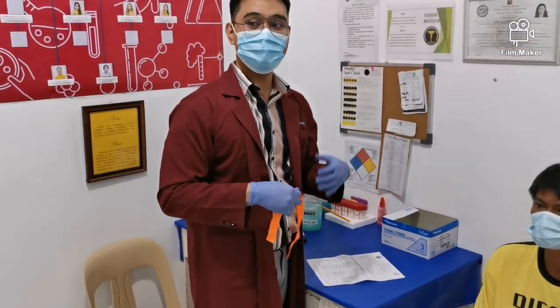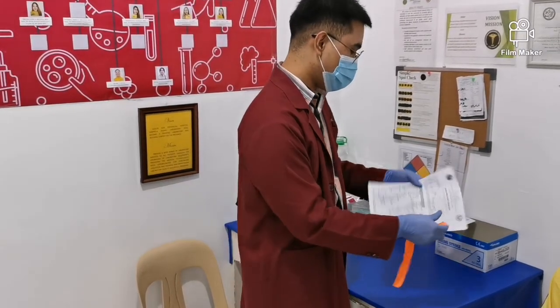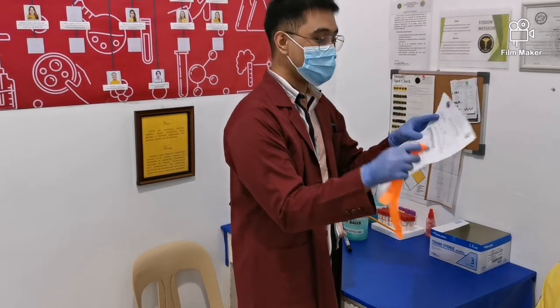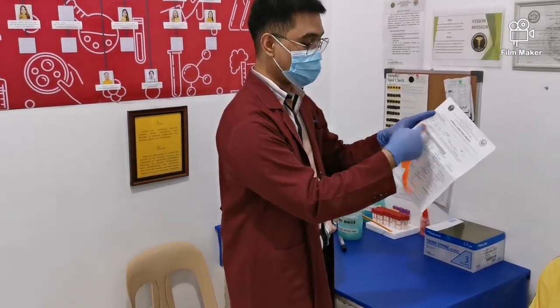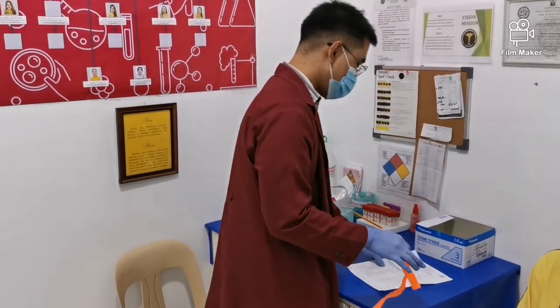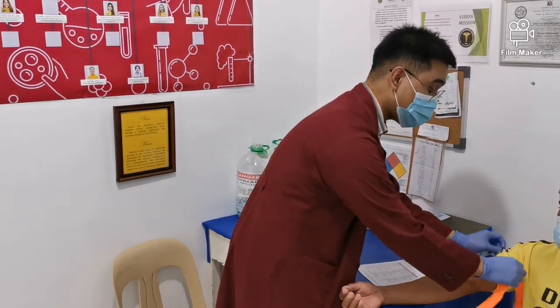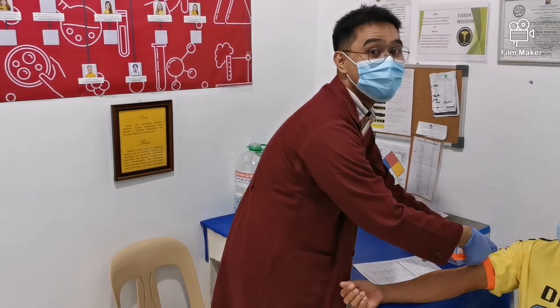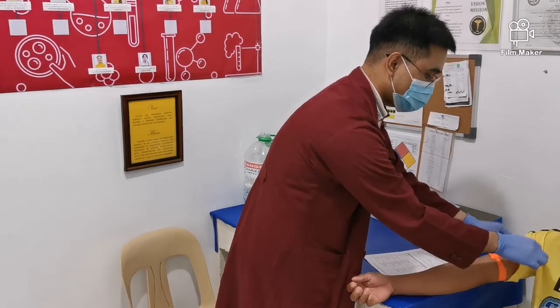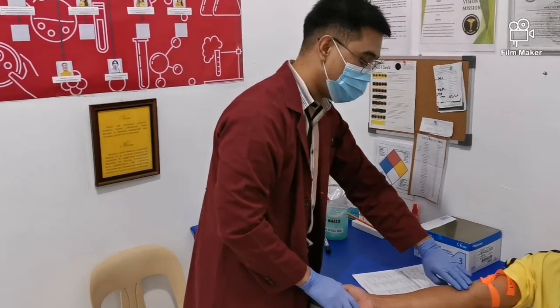So I will demonstrate a phlebotomy procedure, okay? So we will collect the blood specimen on our patient. So of course, the very first thing that we do is to check the request form. So dapat properly filled up yan and then tignan natin kung ano yung request ng pasyente. So yung naka-check lang naman dito is CBC. Okay? Lagyan mo, sir? Marihan mo dito. Ayun. First step din, dapat i-confirm mo kung siya talaga yung pasyente mo. Okay? So tanungin mo yung pangalan. And how do you ask? Tanungin mo, wag mong sabihin, ikaw ba si? Wag mong gawin yon. Okay?